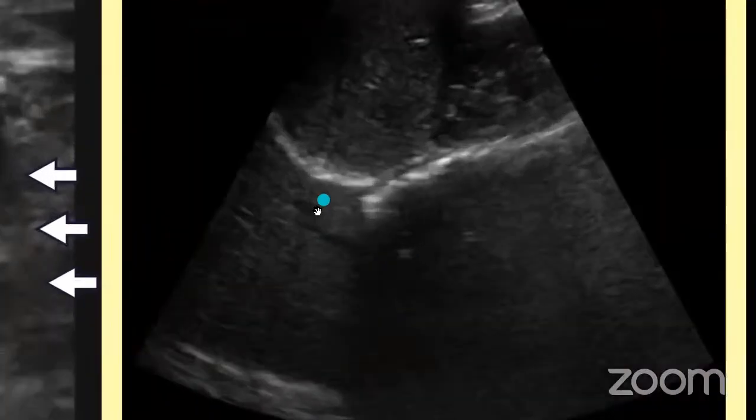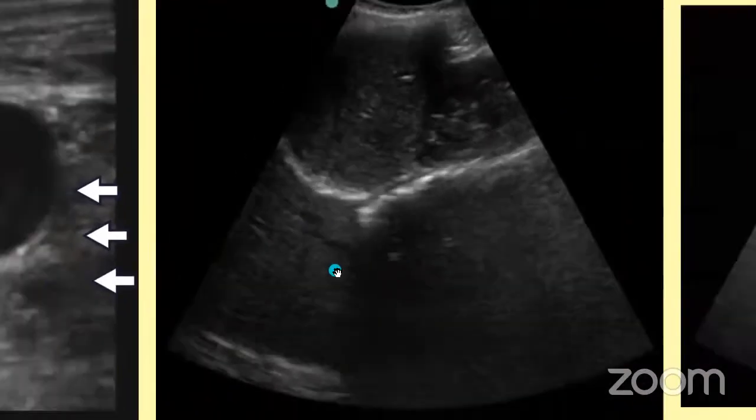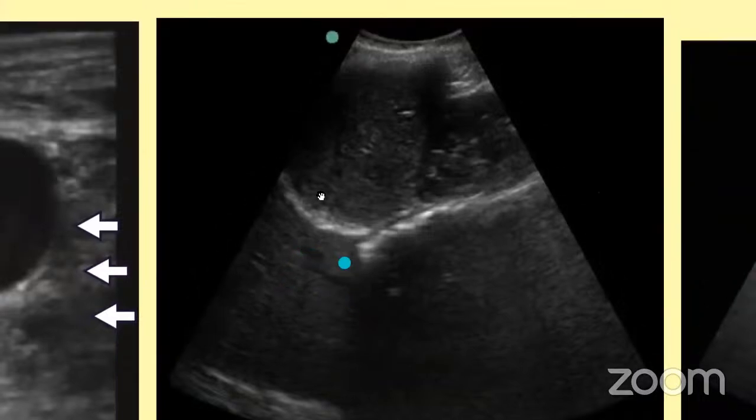This looks very similar to liver tissue. However, this is above the diaphragm, and above the diaphragm, liver won't be present in physiological senses. So why is that happening? It's because the diaphragm surface is much more shiny due to the peritoneum. So what happens? The ultrasound pulses which are traveling across the liver hit the diaphragm, and start reflecting a lot rather than transmitting.